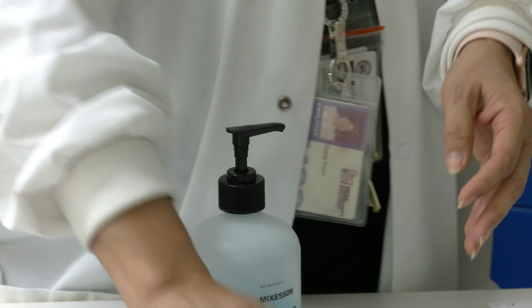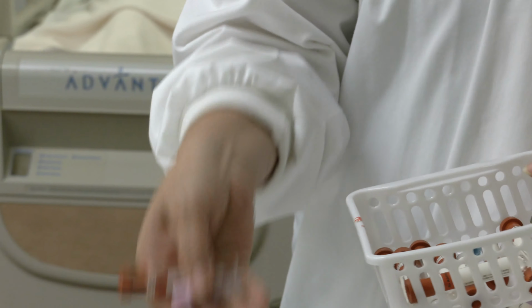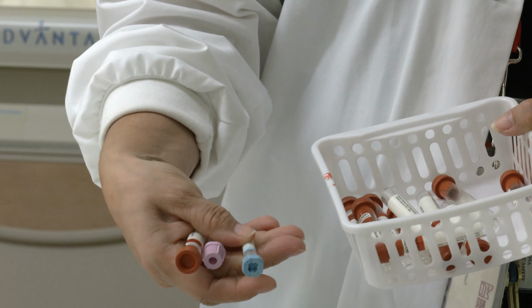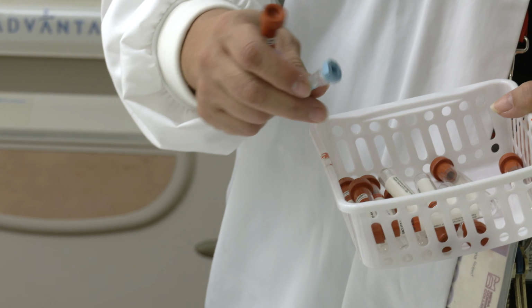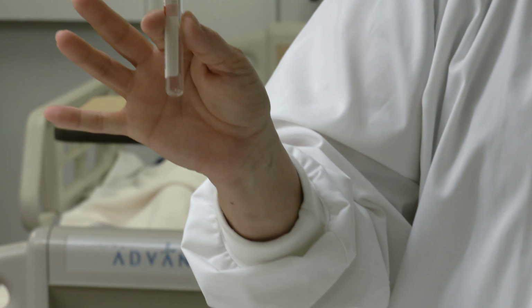We also have different lab tubes. Different colors are for different tests. So purple versus red versus blue, and we're going to talk more about that. But they come in different sizes. It just depends on what you're trying to get. If this is for an infant, then this would be for an adult.